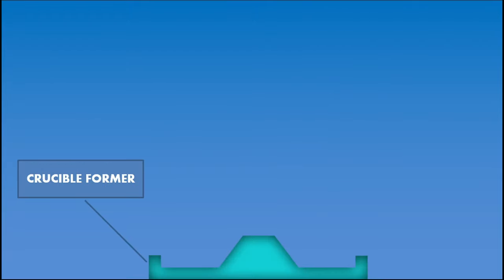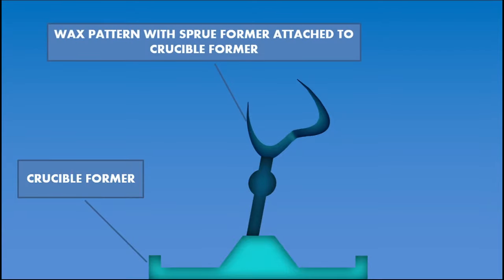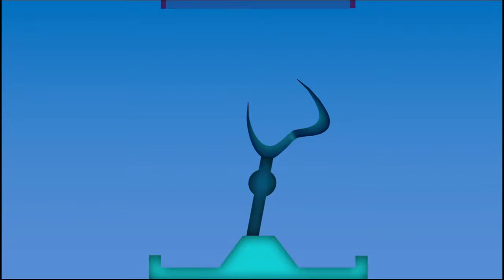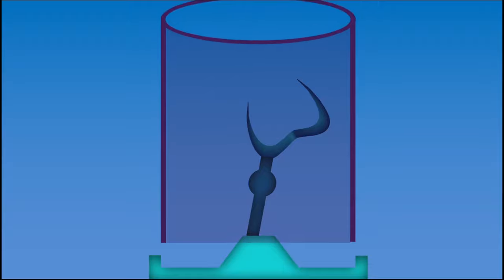Let's now prepare for the casting procedure. A crucible former, which is often made of a flexible material, is placed on the bottom. The wax pattern with the attached sprue former is fixed to the crucible former. We are seeing the wax pattern in cross section for better understanding. Next step is to place the casting ring, which is usually made of metal, with one end contacting the crucible former and the other end open.